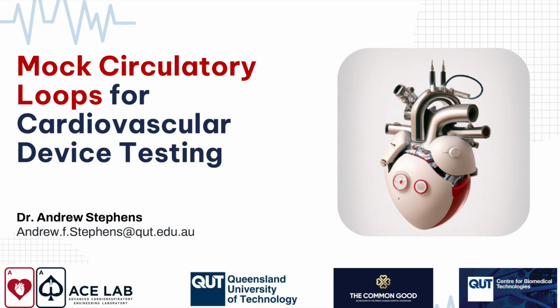So every heartbeat, it's physically moving the amount of trapped air, or you could do it hydraulically as well, to change the stretchiness of the vessel that it's simulating.